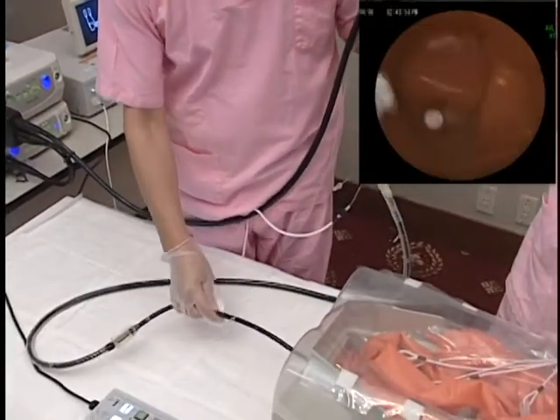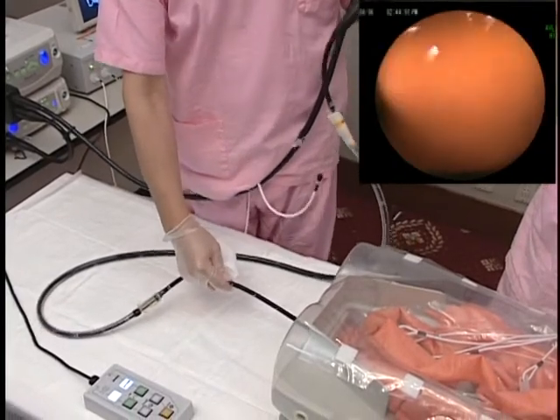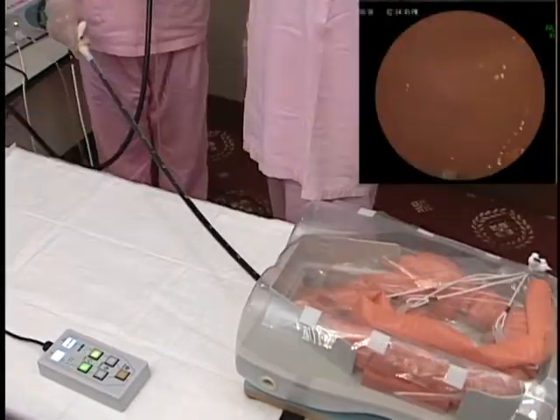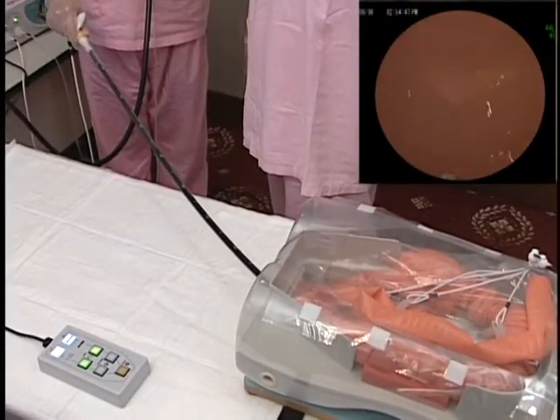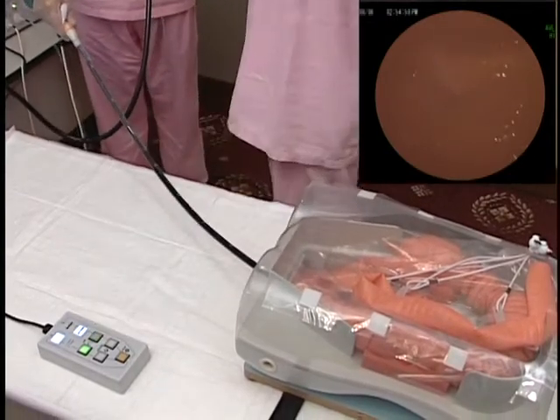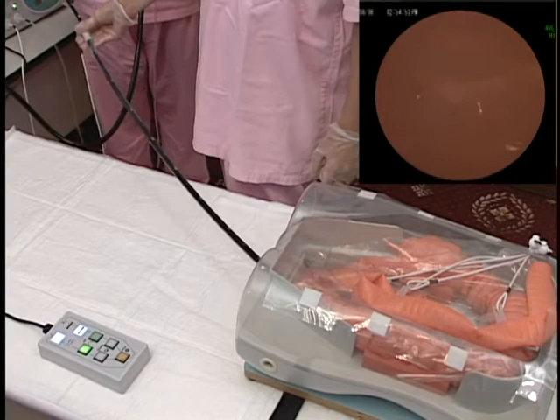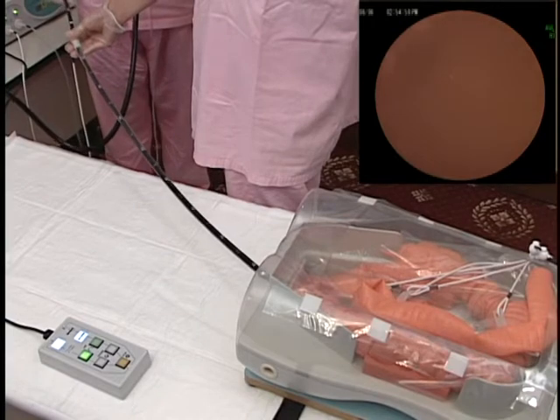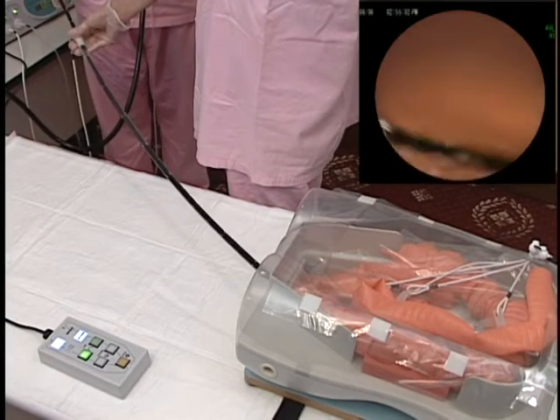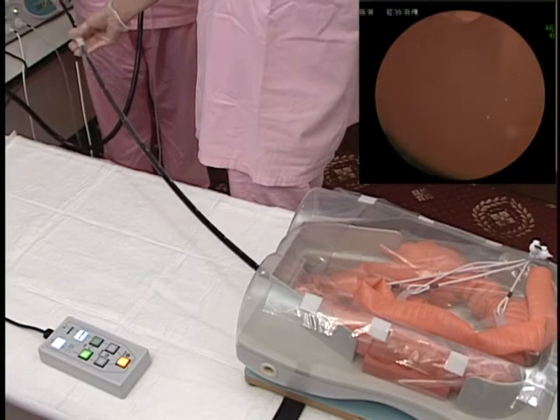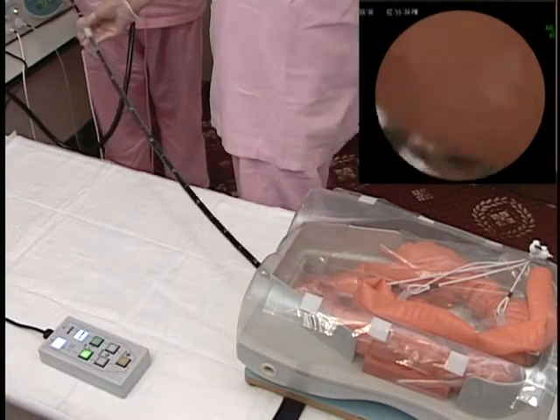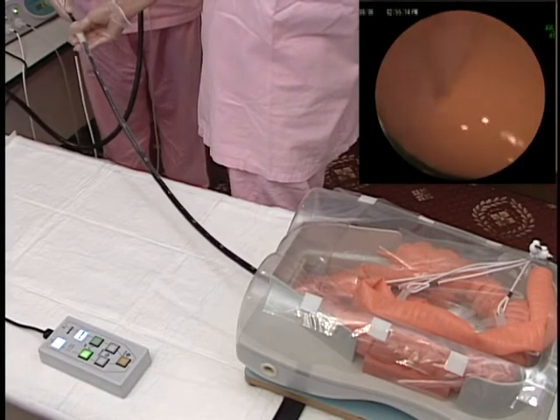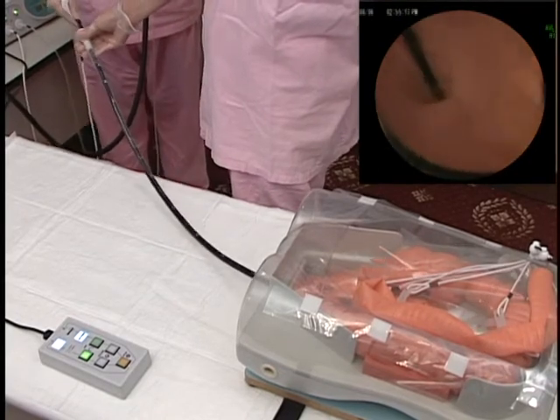Advance the scope into the rectum and sigmoid colon. As needed, move the fixation points with the SD flexure, splenic flexure, transverse colon, and hepatic flexure using the overtube balloon, and advance the scope and overtube to the ascending colon. As needed, confirm the position of the iliocecal valve and advance the scope along the small intestine.